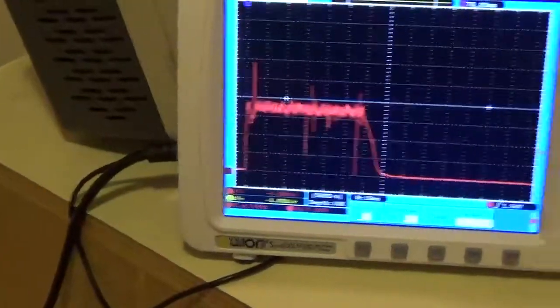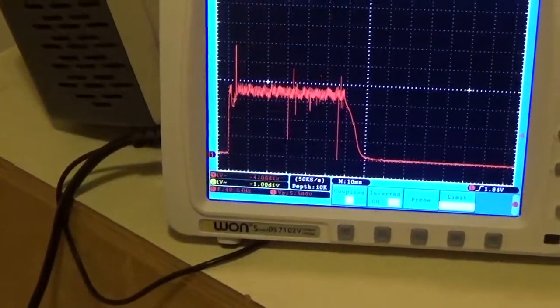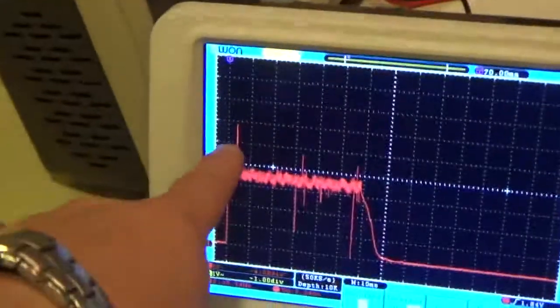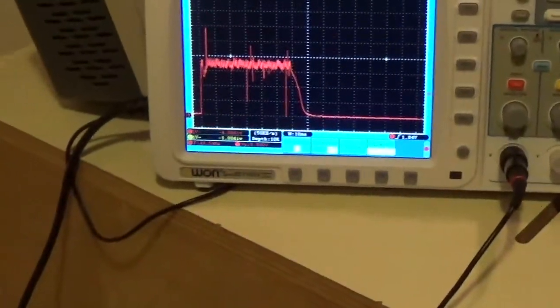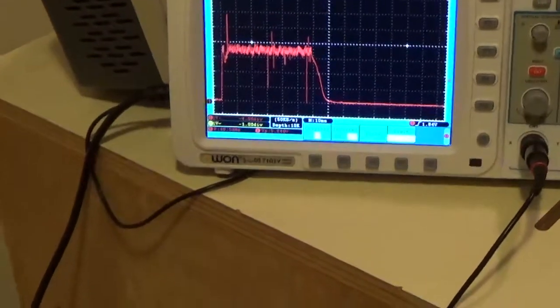So we add 60 milliseconds. And look what our preheat's doing now. Wow. See there? It's a little bit of undershoot. And then that's an overshoot because it was so far under. So we may end up on the low power having a little bit of overshoot.